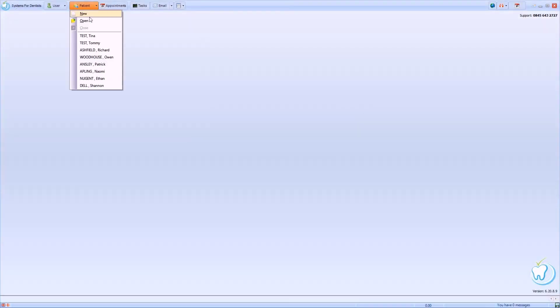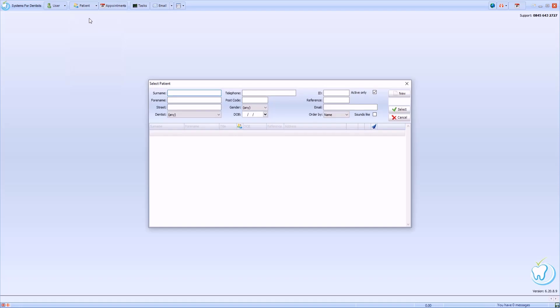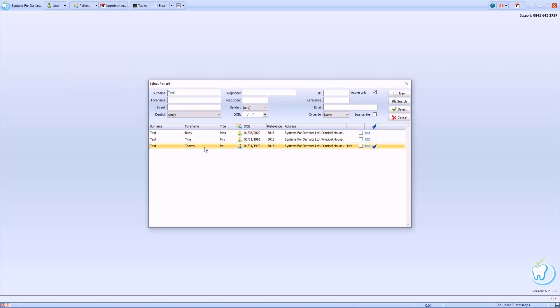Included in SFD is an easy-to-use template for recording BPE values. To demonstrate this, I'll first search for and open a patient record.